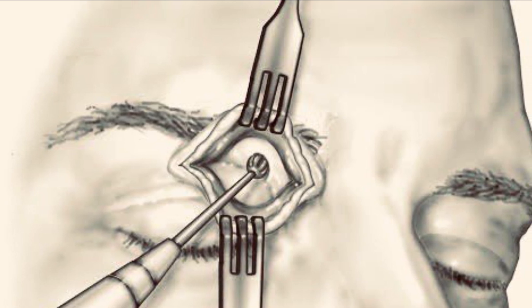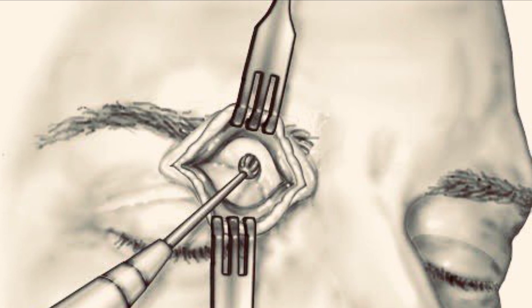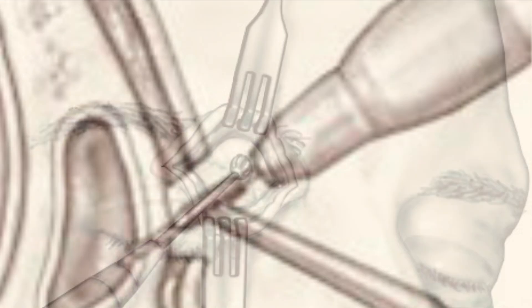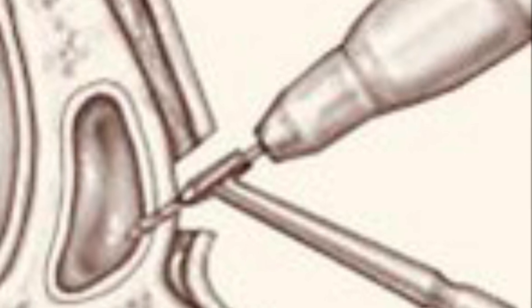Once we've identified the site, we use a 4 millimeter burr to penetrate the anterior table of the frontal sinus. This creates a small opening for inserting endoscopes and instruments. From here, we can assess drainage pathways, remove obstructions, and even irrigate if the anatomy is distorted.